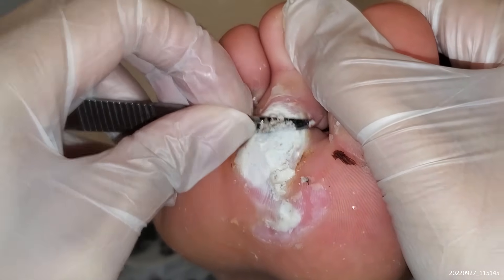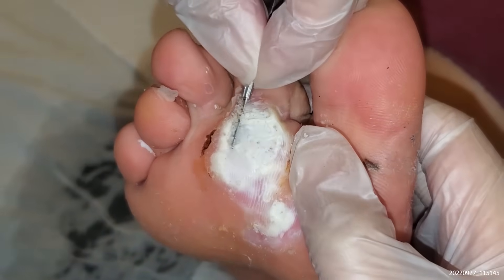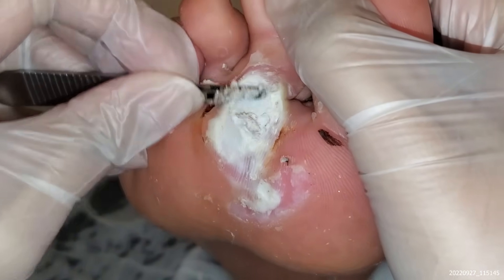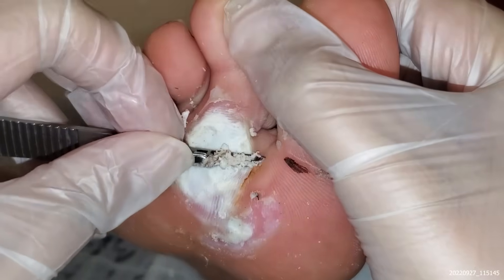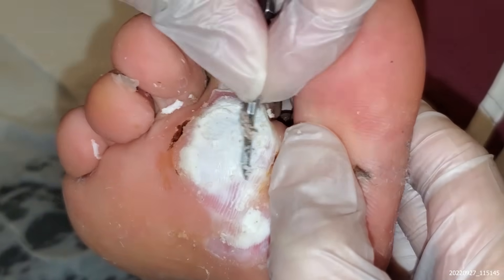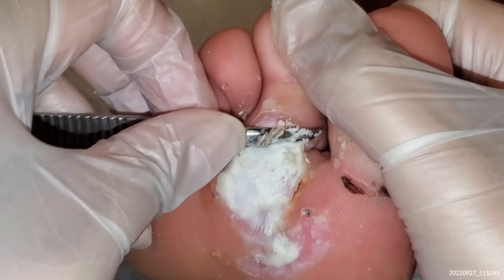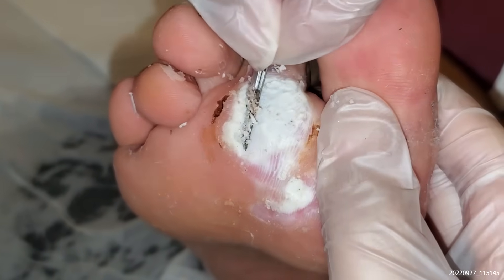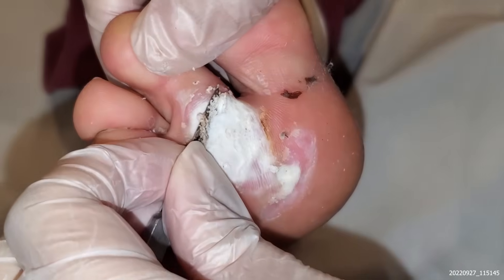You guys might think, what is going on with this white tissue? But that's all the wart tissue and we're scraping it away. What we can see at the base is yes, there's some of it still there, but when she first came — do you remember, Stephanie? — it was really big and cauliflower-y. But actually this looks really, really nice. This bit obviously still needs a bit of work, but this is really, really good. It's probably getting a bit tender now.